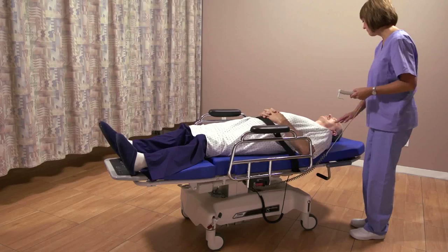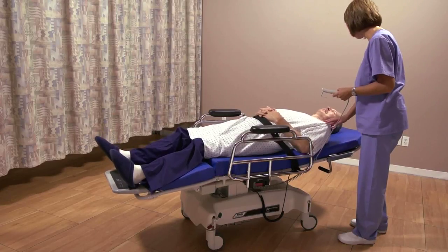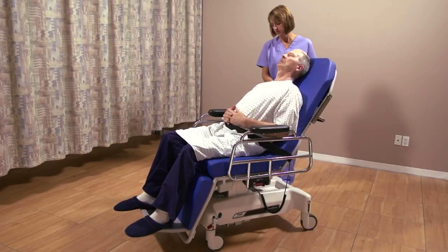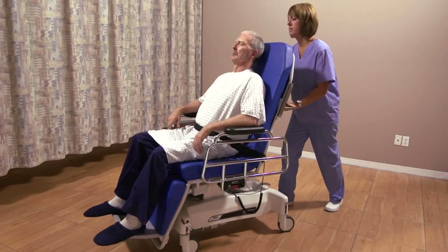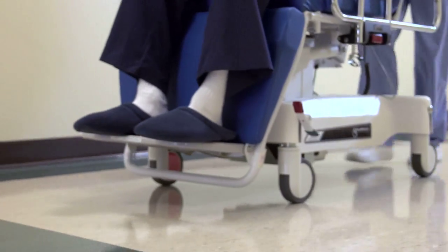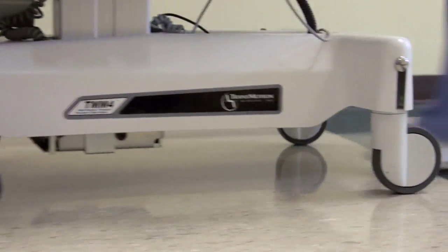At TransMotion Medical, we are committed to making patient handling safer for both nurses and patients. That's why we developed a concept called One Patient, One Surface. Every TransMotion Medical stretcher chair lets a caregiver take a patient from admission to discharge all on a single surface, reducing the risk of nurse injury, reducing the risk of patient falls, saving time, saving money, and improving patient comfort.